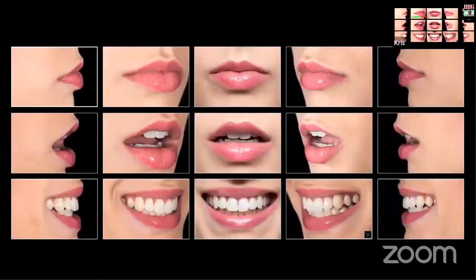But for the clinicians, sometimes it makes sense not only to take the face, but also some close-ups of the teeth. What are specific close-ups or positions for? Of course, it comes from the analysis of the cases and planning. So when you need the lips in contact, when you need teeth apart, when you need a full smile, just to analyze the position of the canines, teeth, asymmetry, symmetries. So this is everything related to the planning, but as well for the communication.